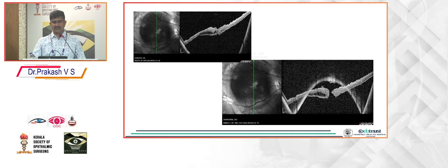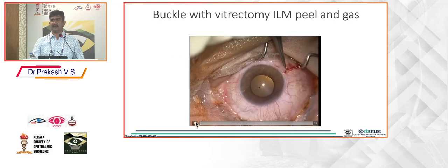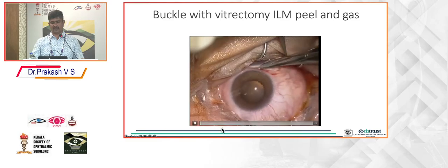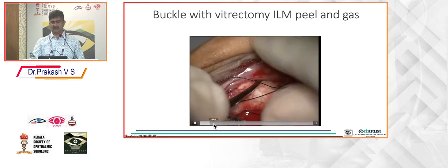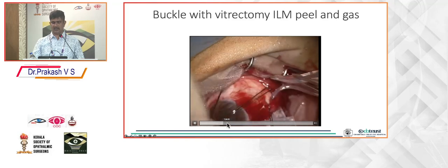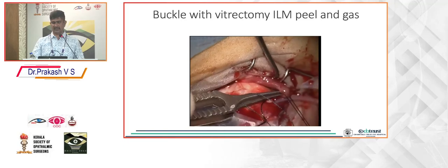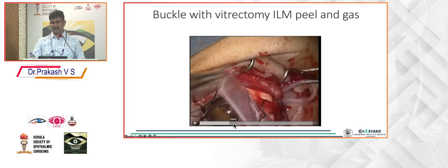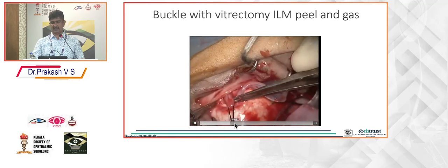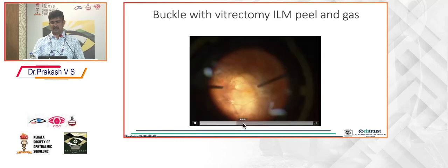This is again one more patient. Here you can see there is a macular hole as well as a detachment. So here the combination of both factors, anterior posterior as well as traction, is happening. So these are ideal cases for combined surgery where you will have to do a vitrectomy as well as macular buckle. So the initial thing is to place a macular buckle. As I told earlier, the inferior oblique is hooked, and this Morin Devin T buckle has 2 elements. One is a 240 band which is passed under the inferior oblique. Then it has a T-shaped element which we place under the macula. So that is like doing any other buckle.